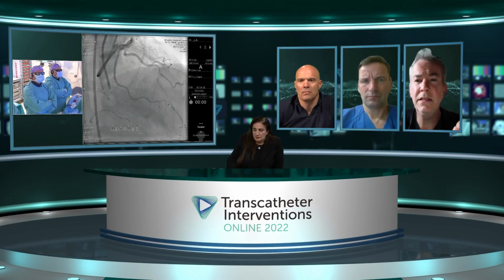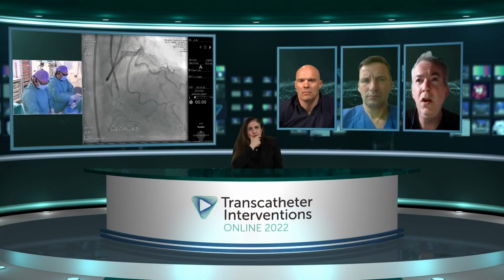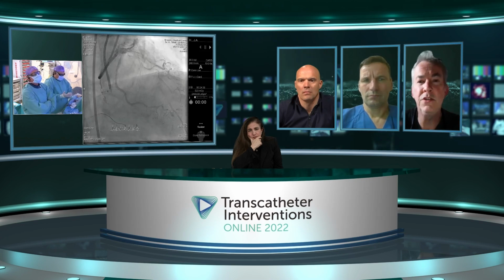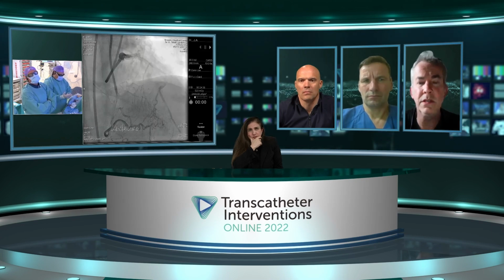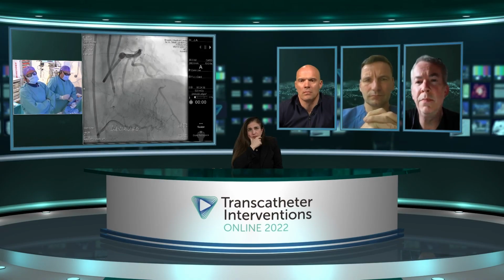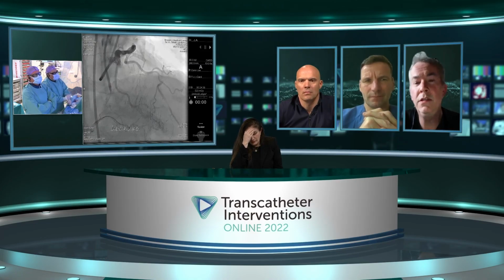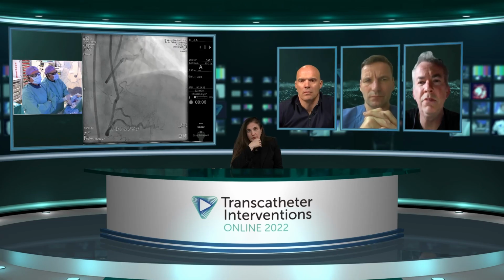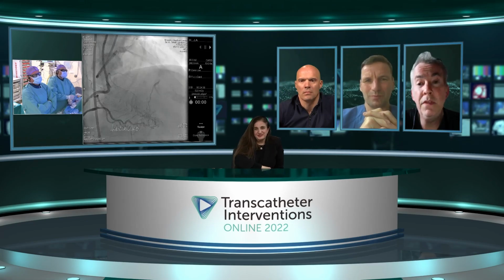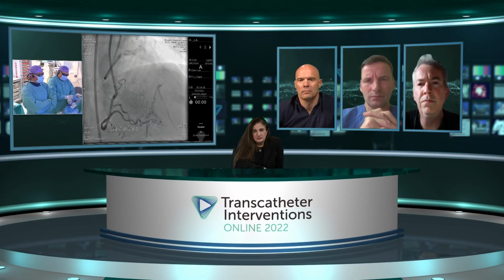If we didn't have that, then I think what has happened so far was, in a sense, quite an elegant way of trying to ensure that the case became a little bit safer. Because, of course, one of the terrible dangers of doing an ostial LAD retrograde, which this is highly likely to be, is that you go retrograde with your subintimal plane track and close off the circumflex. So what they've done is a kind of stent reverse CART, but into a partial donor vessel. So I think they've made it safer. I am slightly concerned about the appearance of the left main and what the cause behind that is.